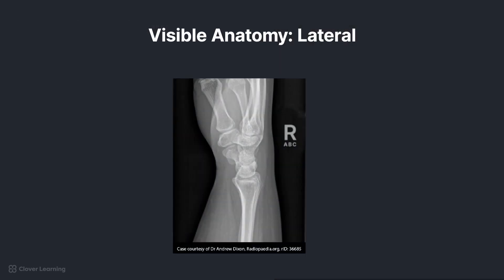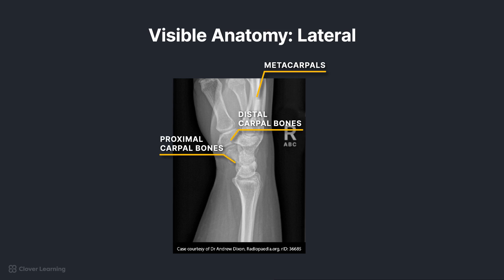Like the hand, wrist anatomy can be most difficult to distinguish in the lateral projection. Working from the most distal to the most proximal anatomy, we again have the proximal metacarpals with two through four superimposed, superimposed distal and proximal rows of carpal bones, as well as the superimposed distal radius and ulna.